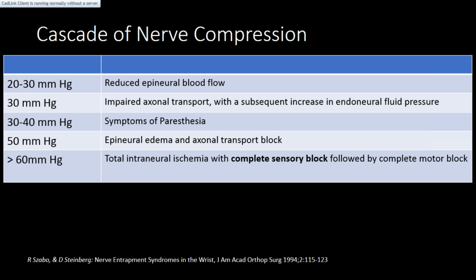So in the case that I just presented, with EMG studies, we had conduction block of sensory fibers, and the motor studies were normal. And with ultrasound imaging, we looked at the structural part of the carpal tunnel, and we looked at the fascicles that were involved. So if you put all this together, all pieces of the puzzle put together, they all point towards the vascular causation of carpal tunnel syndrome. So this is acute carpal tunnel with the vascular causation.